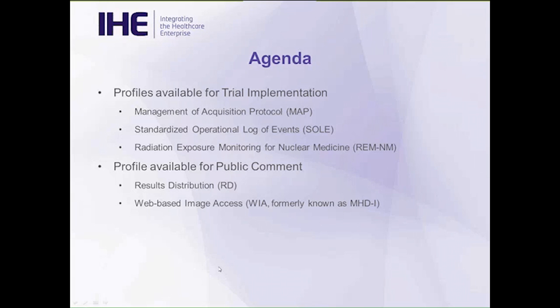Another profile developed for trial implementation was the radiation exposure monitoring for nuclear medicine, the REM-NM. The supplement was published in 2016 and addresses the tracking and reporting and management of radiopharmaceutical administered doses in a manner similar to others that are already adopted for ionizing radiation via the REM profile.